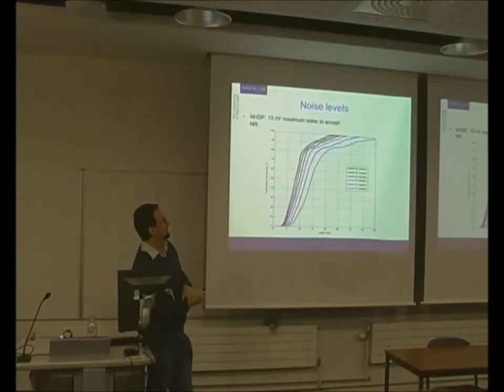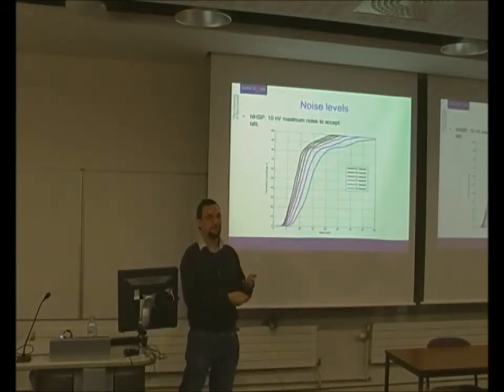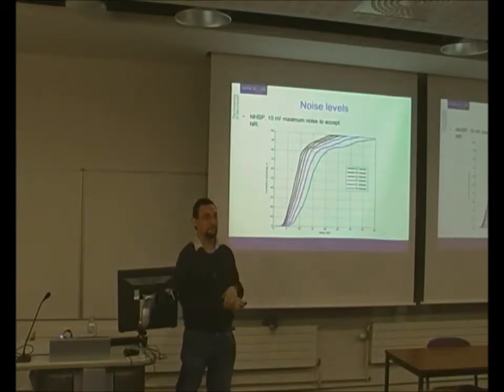And we can just look at the effect across different times as well. You can see where the benefit is. So really what we're saying is to have 80% as a conclusive result, we have to change, so 45 sweeps, we've got 10 nanovolts, and we have to use 20 nanovolts for 15 sweeps. And if we're using a higher noise acceptability criterion, then that means that we're going to have responses that are further away from our actual threshold, because there's more noise and we're not being able to detect those small thresholds.